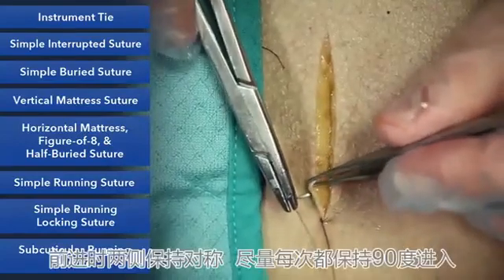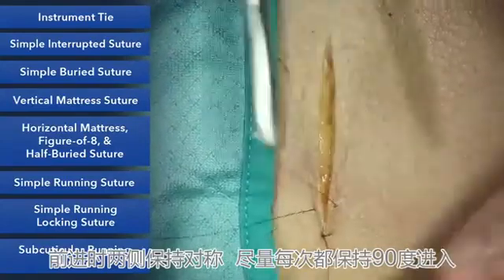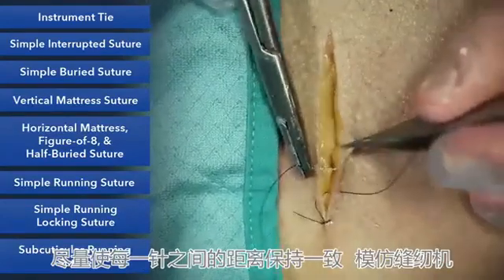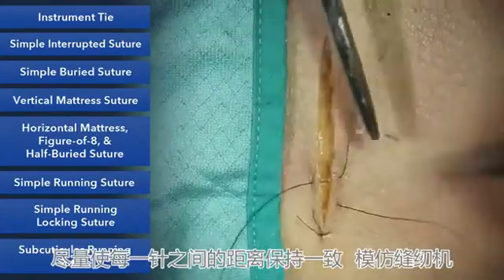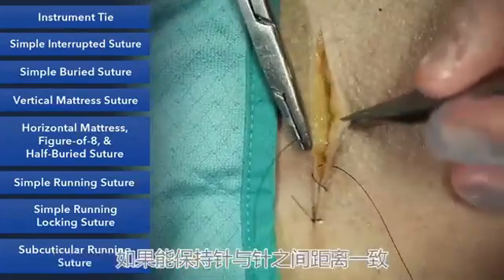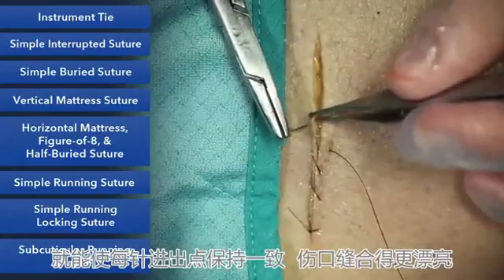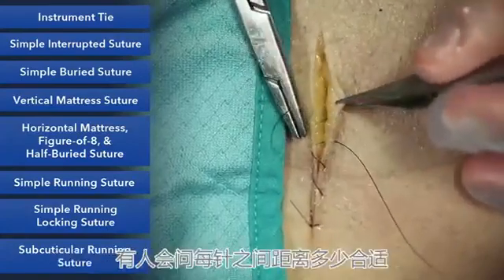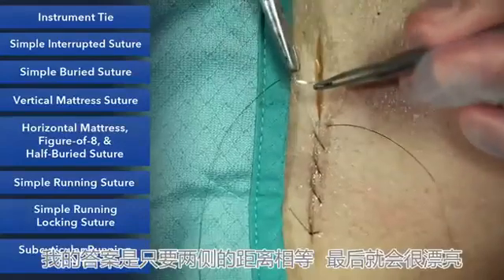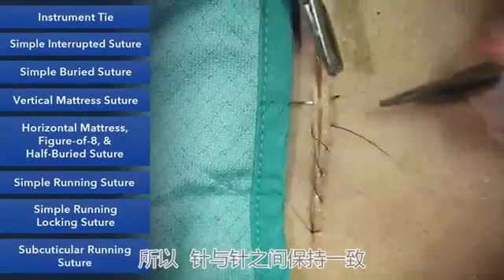You'll advance on the wound in symmetric fashion. Again, trying to take 90-degree bites each time. Try to move along at the same pace and same amount each time, almost mimicking a sewing machine. If you move along the same distance each time and take the same bites on each side, you have a beautiful cosmetic closure. People will ask, well, how much do you move along? My answer is, as long as it's the same on both sides, it'll end up looking very nice. So be consistent in your bites.